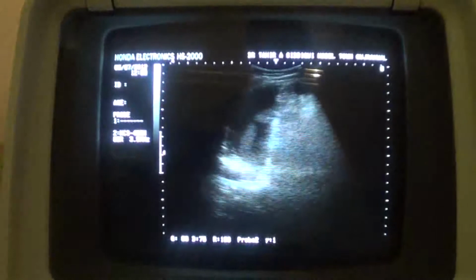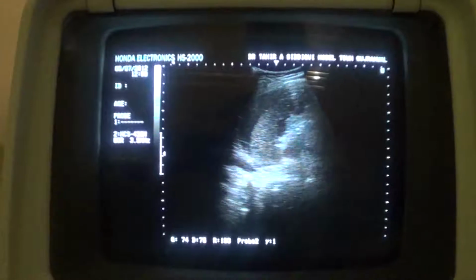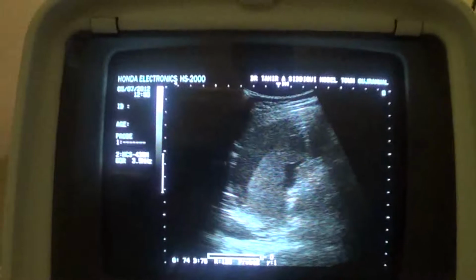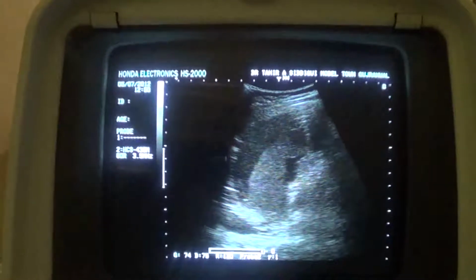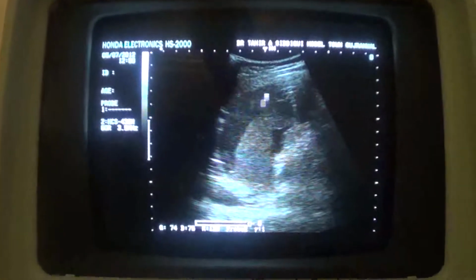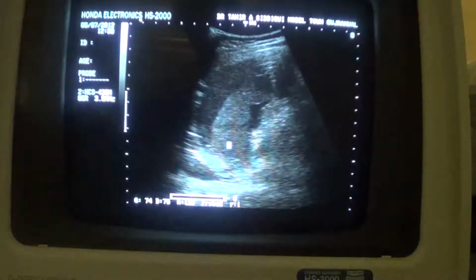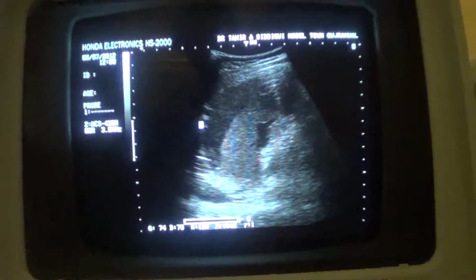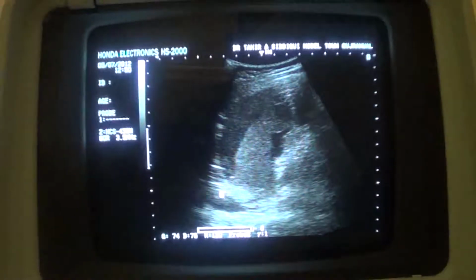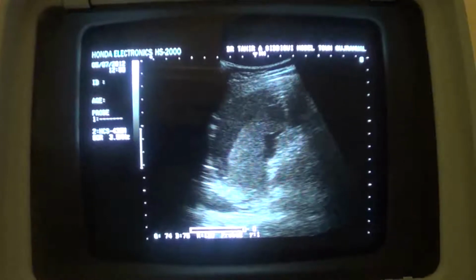And it is seen surrounding the spleen. Now you see that here not only does it surround, there is cystic fluid. This is the bleed. This is the area of spleen. This is the spleen. So this is the fluid with echoes. Bleed. This is the fluid with echoes. This is the spleen, and this is the right hemidiaphragm. Left hemidiaphragm. This is the fluid in the pleural space. So this is a minimal pleural effusion. It is reactive or sympathetic. Thank you very much.